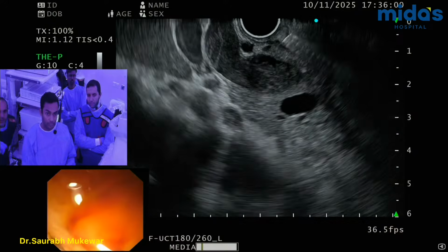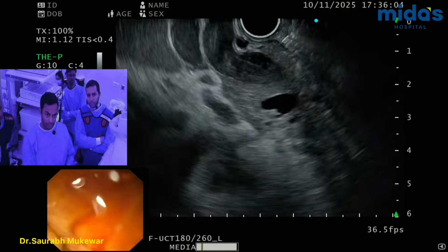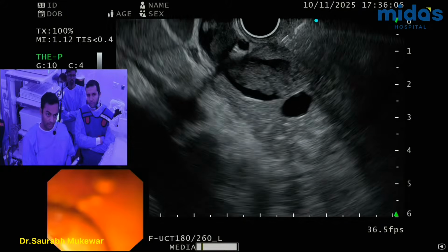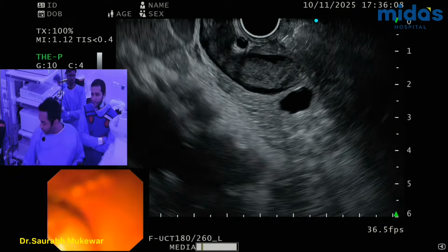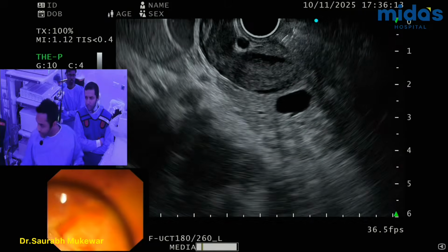This one below is PD, no? PD is below, yeah. There's one vessel up there. No, what do you mean puncture killer? If nobody's here, if I don't have a technician, I'm not going to puncture the needle here.